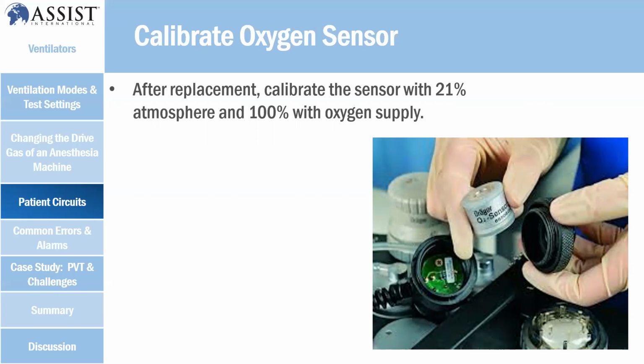Because sometimes you put your oxygen at 99, but it will show 97. That maybe looks good, but sometimes when your oxygen setting is 99, it's going to show 100 above or error. So always remember, when you change your sensor, you calibrate as well.